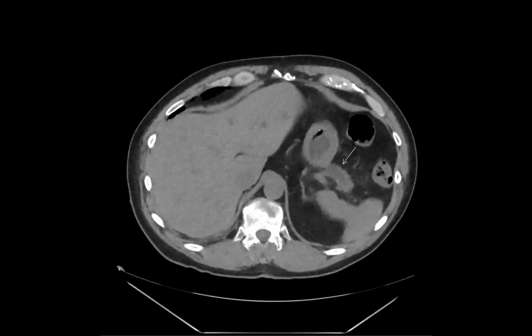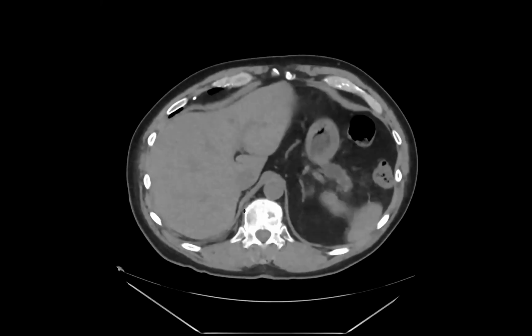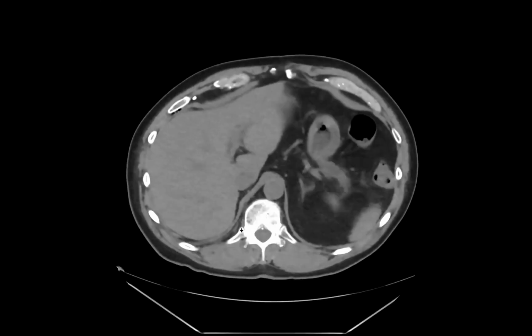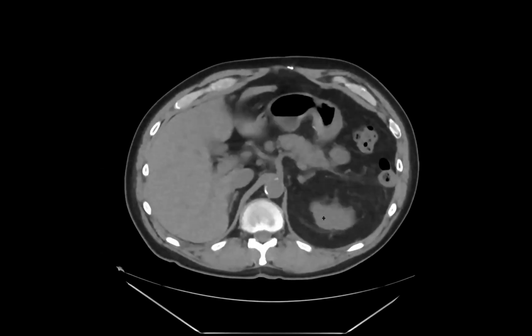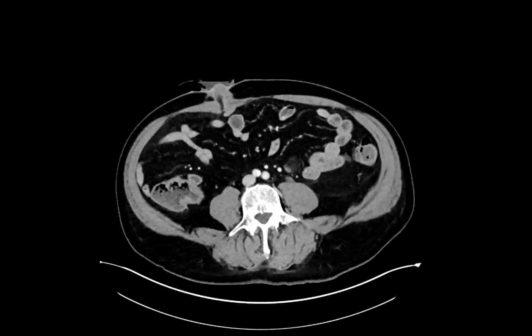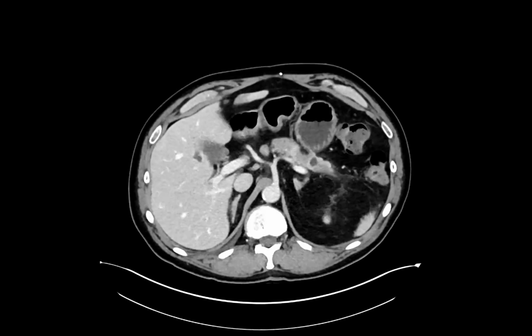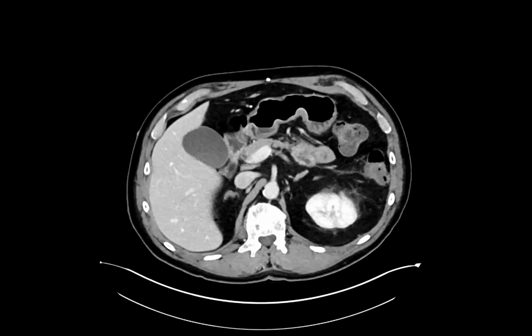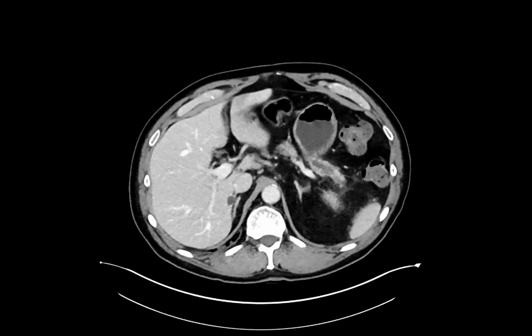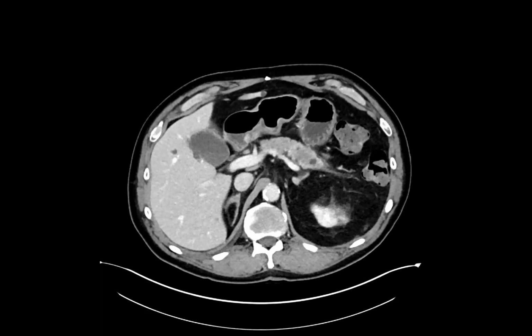So on this study, the pancreas started to look a little off. Looks like there's a dilated duct in the tail and maybe a cutoff sign. Yeah, and so then the patient went on to get a contrast enhanced exam. And this one came back as pancreatic ductal adenocarcinoma that was hiding this whole time because we had all these non-cons. It was just really hard to pick up until it became apparent on non-con imaging. But if we had contrast enhanced, then it would have been probably picked up earlier.